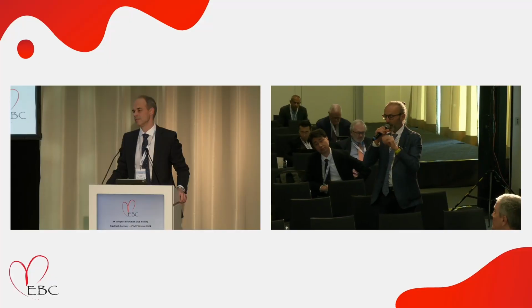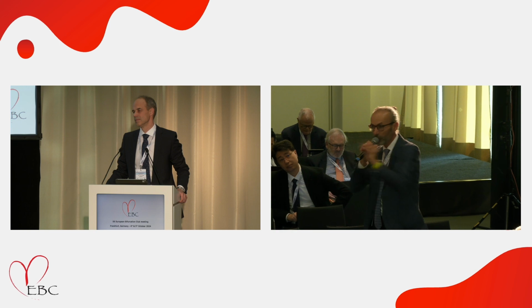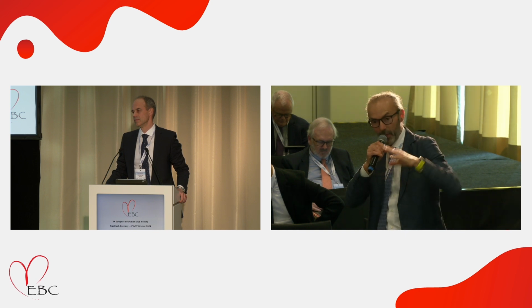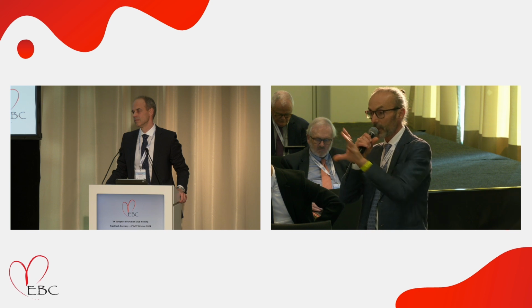This allows stabilizing everything, because the ostium of the circ is dancing because of the motion. When you inflate the balloon in the left main LAD, you pull your stent in the circ, and you can position precisely. In addition, if you size this balloon to the distal main vessel, you can still inject and see, because there is some flow below the left main.